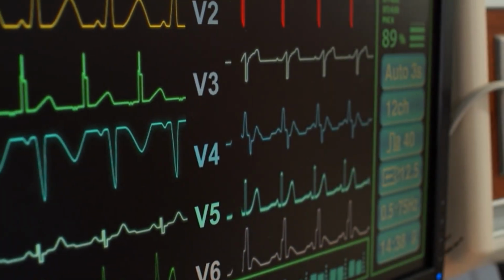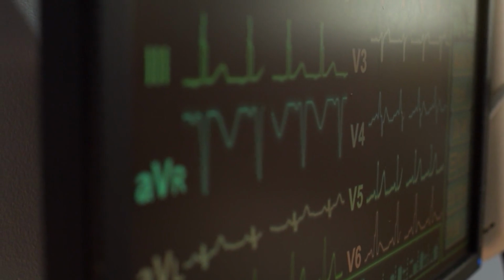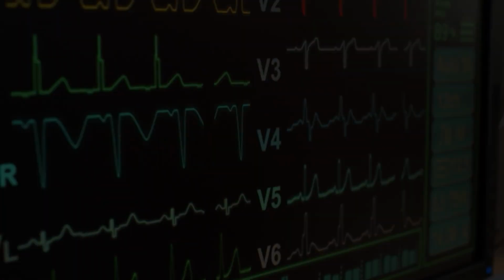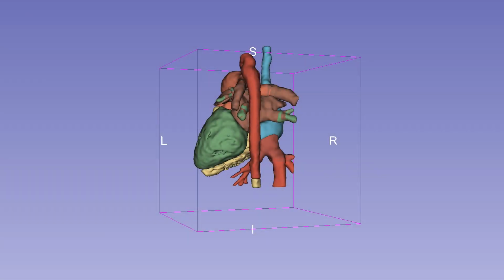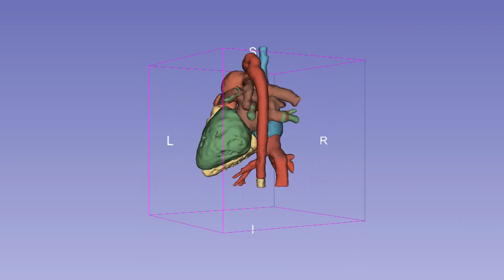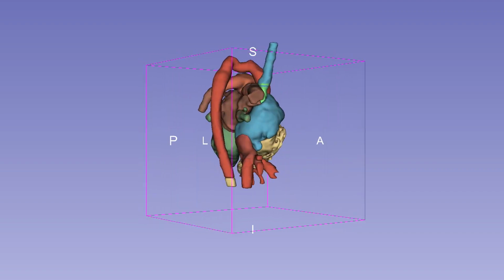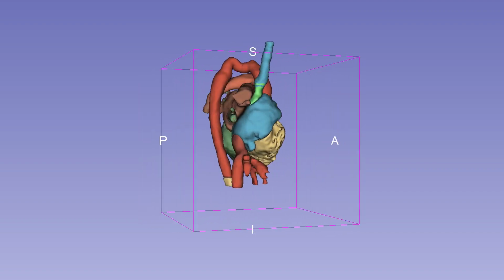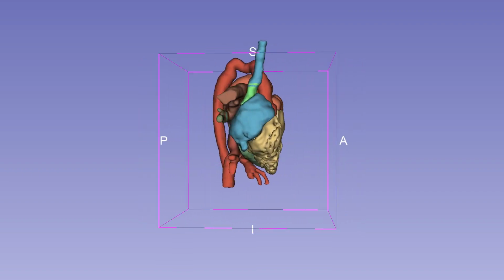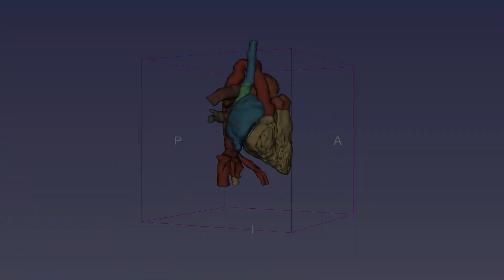In this chapter, we'll explore what makes the HVSMR 2.0 dataset distinct and how it contributes to CHD research and treatment. HVSMR 2.0 provides a diverse representation of CHD cases spanning mild to severe defects. But the whole heart segmentation is the key feature of this dataset. It consists of 20 manually segmented scans, and the remaining 40 scans are segmented through a semi-automated process.